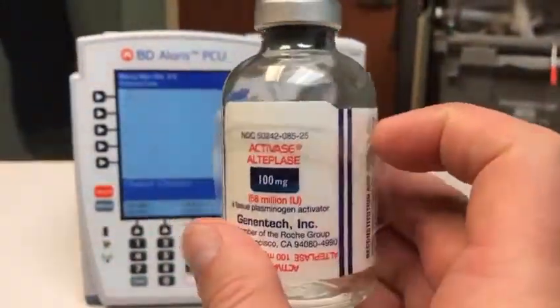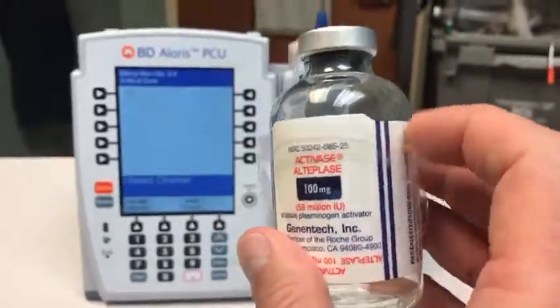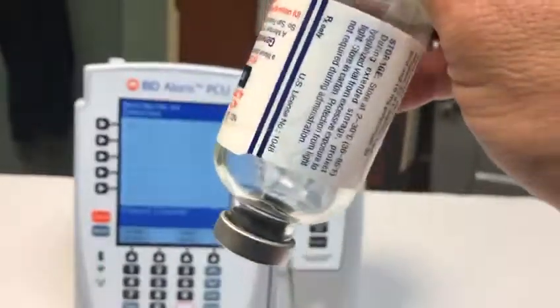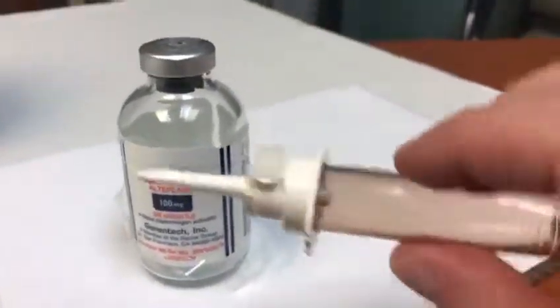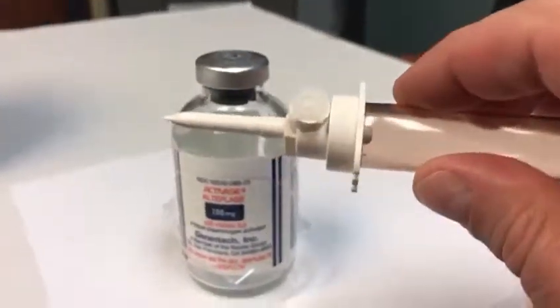Now, this glass vial is very similar to ones that you would see with, let's say, propofol or nitro, where they have this little tag, or this little loop, that you can pull down and actually hang from the IV pole itself. So very similar to those preparations. When we go to spike this, we definitely want to do it in a certain fashion. So we take the drip chamber here. Remember, we've got this little vent cap here. We want to keep it closed until the appropriate time.